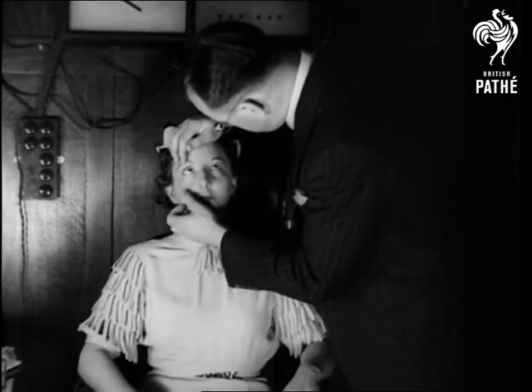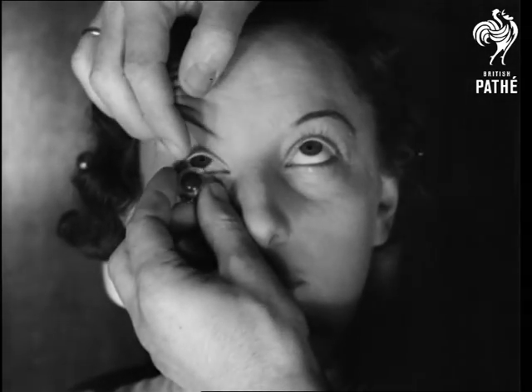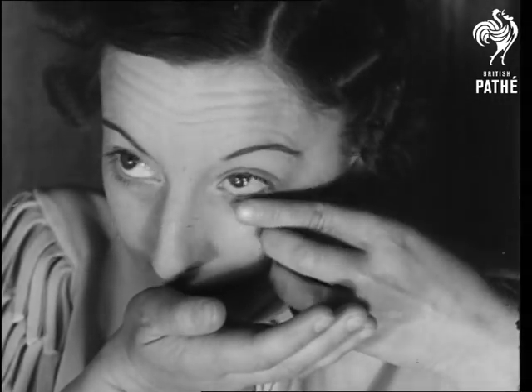It's shaped like the eye and placed under the lid — just a wafer of curved crystal glass. Now the other eye, and even your best friend wouldn't know. But each lens costs seven pounds, and that's a blinking shame. So you can't be too careful how you put them away.